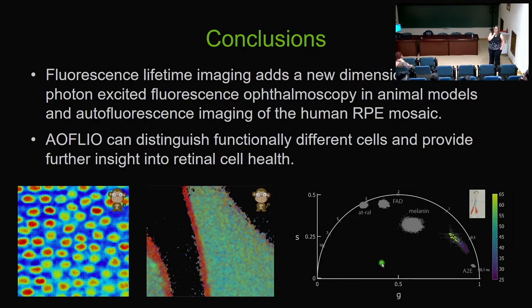It's a difficult question to answer. It's a good question. We are very conscious that absolute concentrations can play a role. So we're very interested in relative concentrations. And so we often have these discussions and debates. I think of it as your absolute concentrations dictate your fluorescence intensity. Your relative concentrations dictate where you are in phasor space. And so differentiating those becomes important.